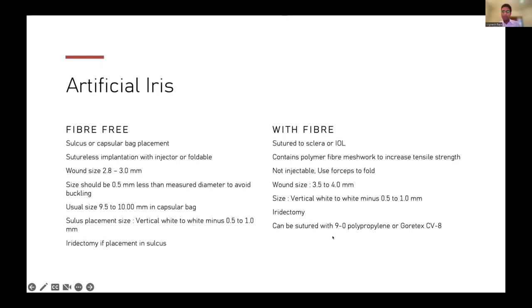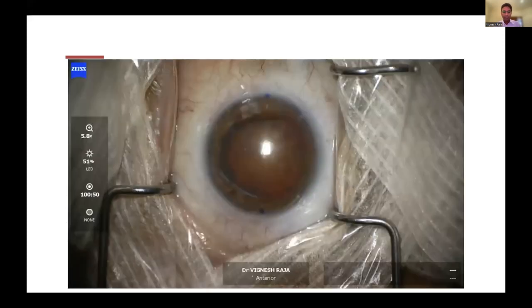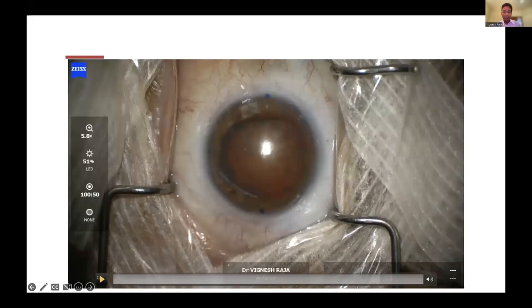You can either use polypropylene or Gore-Tex sutures. So the iris can be implanted either in the bag, in the sulcus, or with scleral fixation with Gore-Tex or polypropylene. I prefer to use Gore-Tex sutures because you don't want late breakages with polypropylene later on. Or you can also use an iris-IOL complex fixation using Gore-Tex or the Yamane technique. I have a few videos to show all of you, so let me go on to these videos. All these are post-trauma eyes.